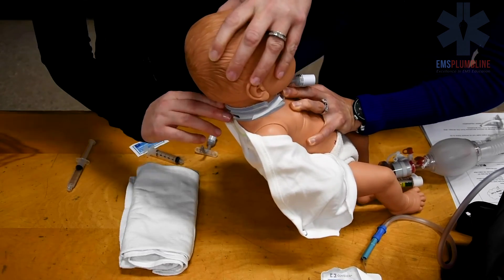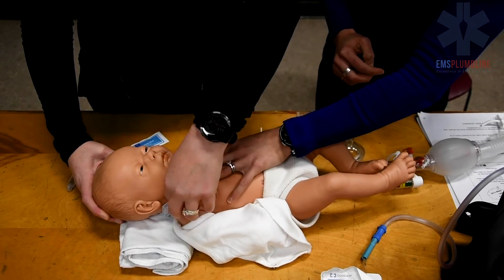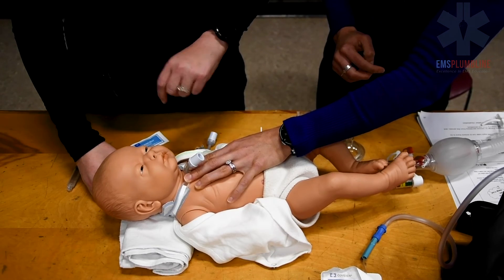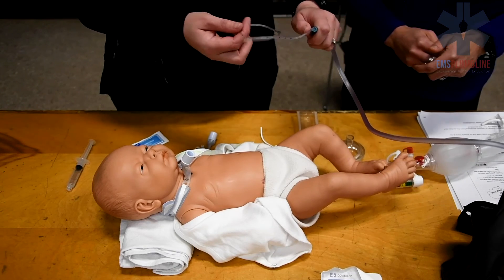Readjust the trach tube's ties to ensure that no more than one finger can fit under the trach ties. Now re-suction the child and re-suction the trach tube.